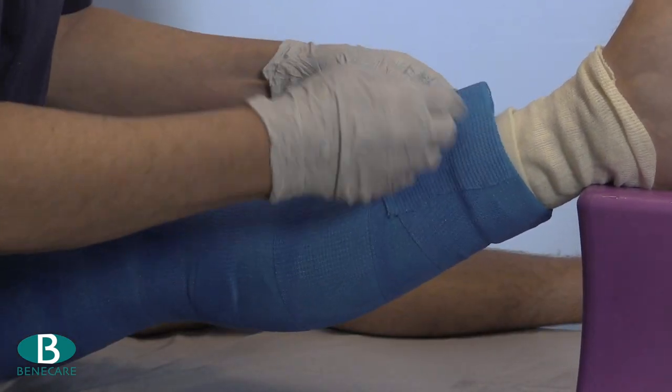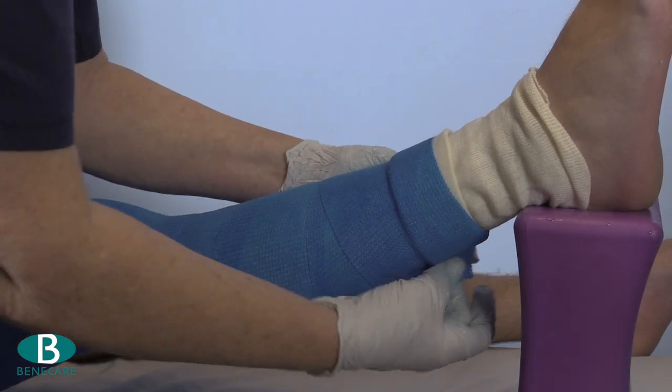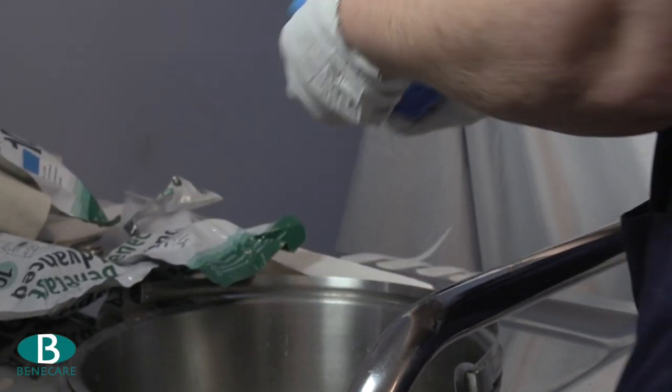Secure this using the remainder of the bandage, covering just less than 50% of the previous turn, working from one end of the limb to the other.